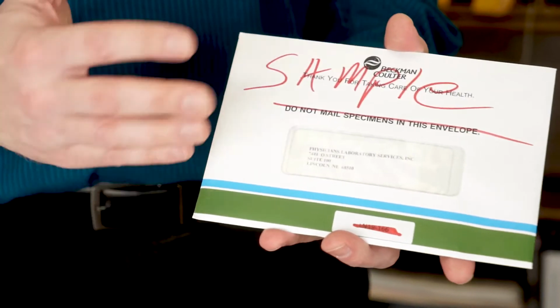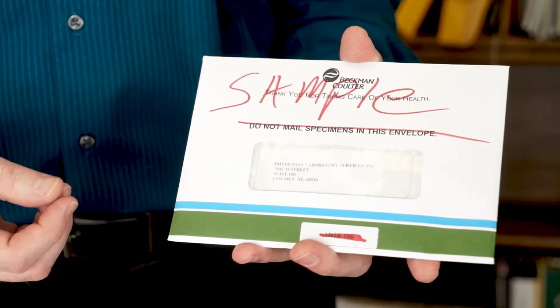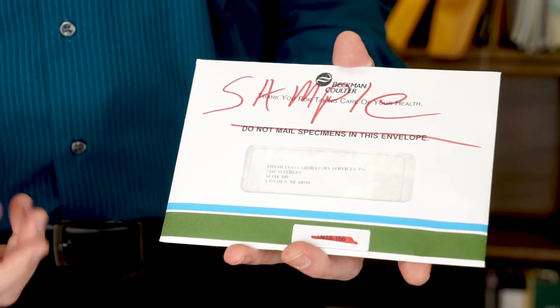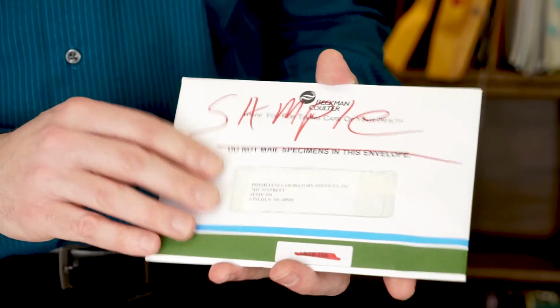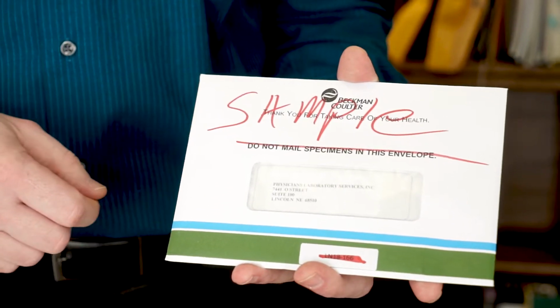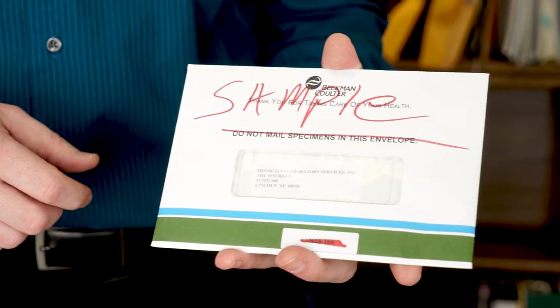Again, these are the kits. You usually bind them in about 25. Each pharmacy will get about 25 to 40 of these to start out with. Of course, if you run out, there's contact information to let us know if you need more. Another thing we added this year was a sample FOBT kit for pharmacy staff to provide education to customers when they have questions. We found that the more education that's done up front when people are picking up kits, the more comfortable they feel about completing the kits and the more likely they are to return it for testing.